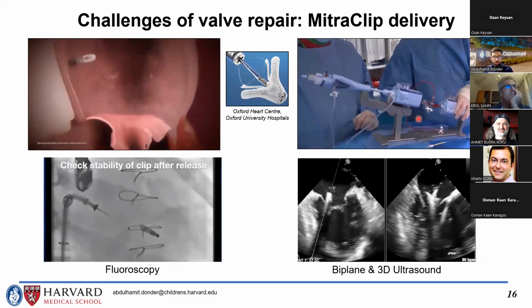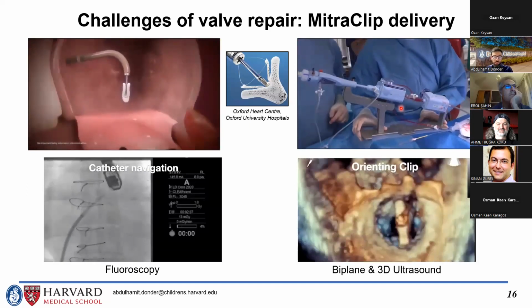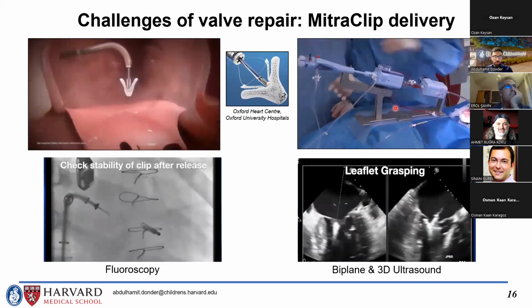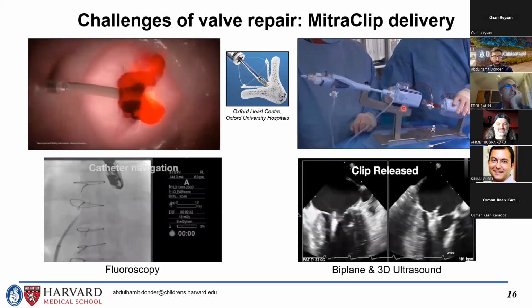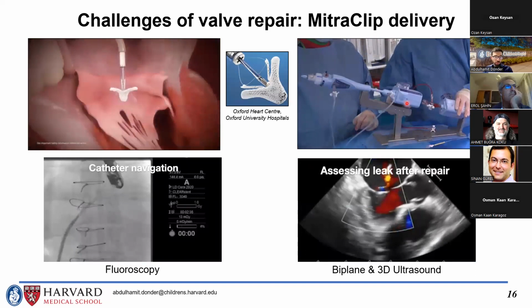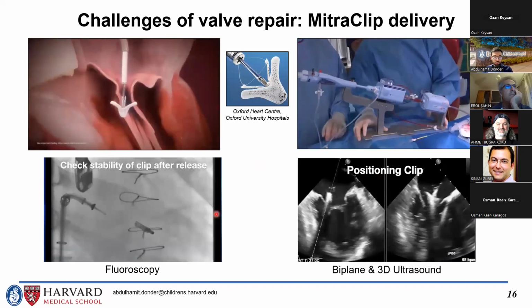And given that it is this complex to use, and this is a procedure conducted in the beating heart, which means there is very little room for a mistake. It requires most cardiologists to conduct a few hundred procedures a year to become and stay good at it. So robotics might be able to help with this. Now let me look at the imaging used to guide the catheter.